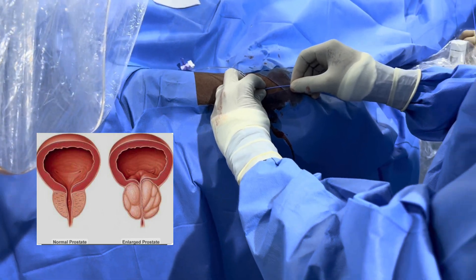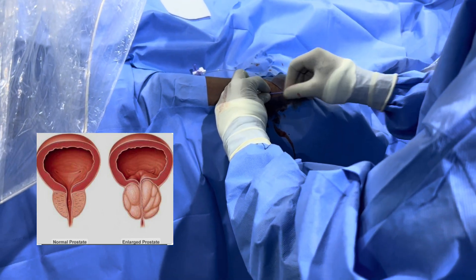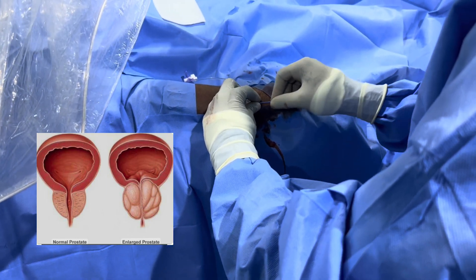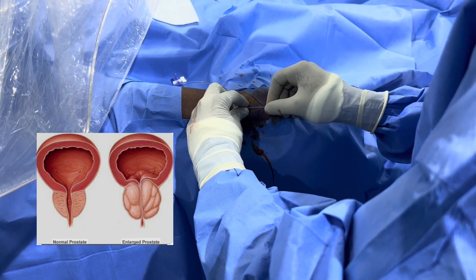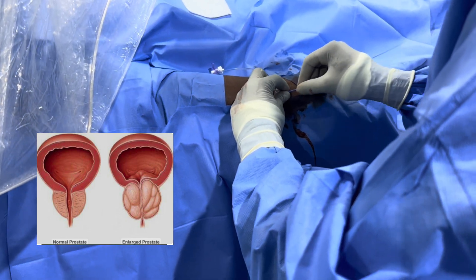We're starting a prostate artery embolization procedure this morning. Prostate artery embolization is a procedure for treatment of enlarged prostates.